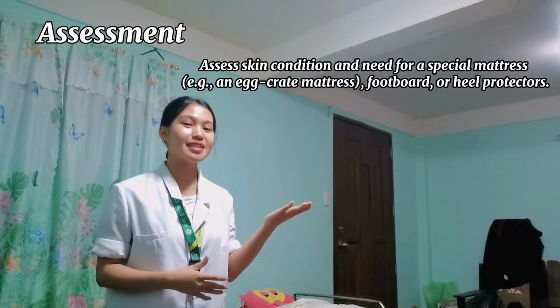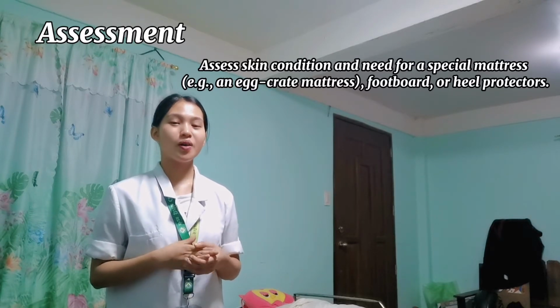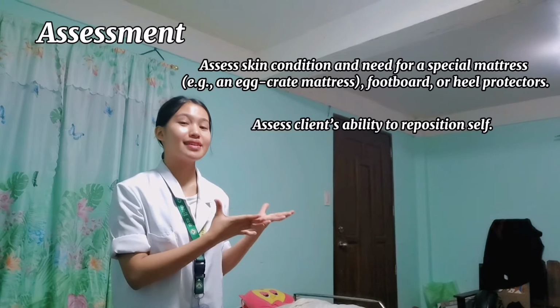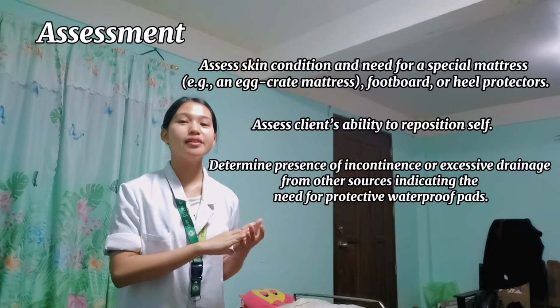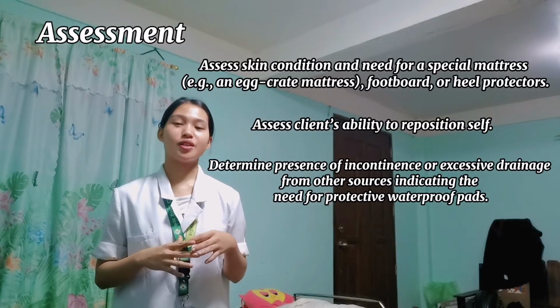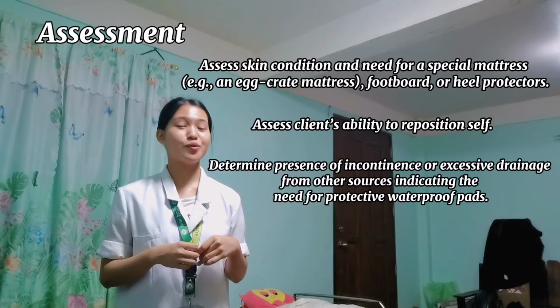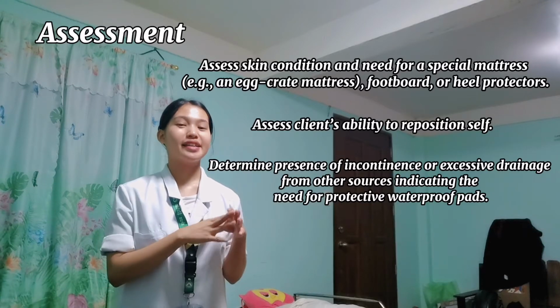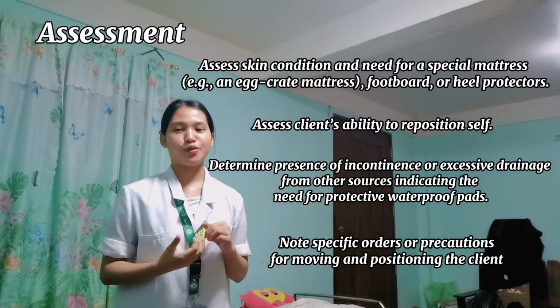For the assessment, the following are a must. Assess skin condition and need for a special mattress, footboard, or heel protectors. Assess client's ability to reposition itself. Determine presence of incontinence or excessive drainage from other sources, indicating the need for protective waterproof pads. And last is note specific orders or precautions for moving and positioning the client.